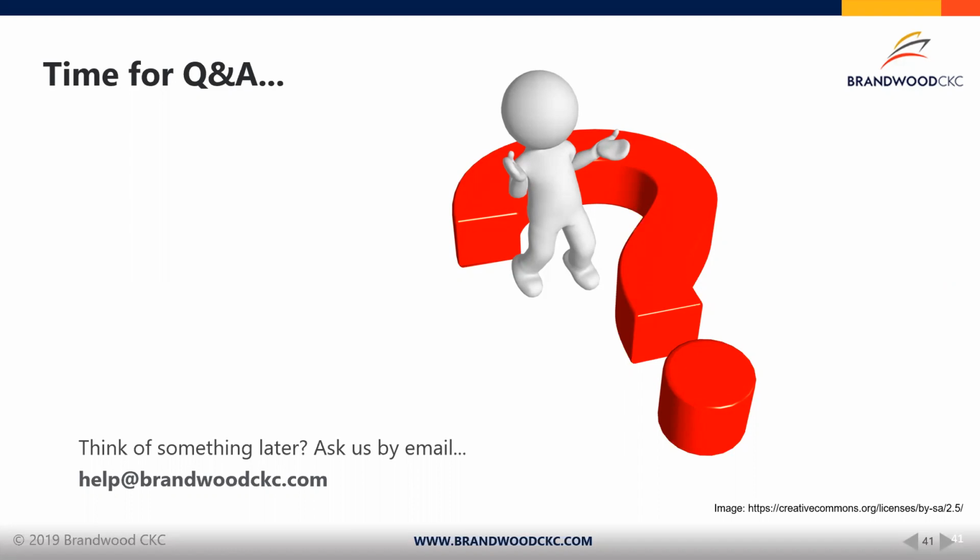Yeah, completely agree. The next question we received as part of this webinar: would clinical decision support software be considered software as a medical device? Well, I think we partially answered this as part of the presentation. The short answer would be yes. However, this is something we need to investigate on a case-by-case basis. What is the kind of data that's provided? Who's the final user of this data?